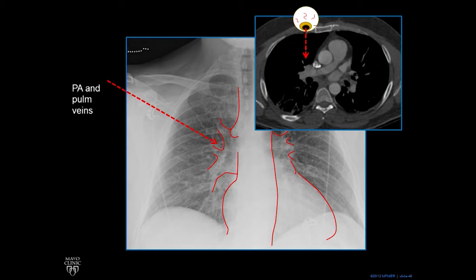We see a pulmonary artery, which is this sweeping structure, and then right in front of it, a little circular structure — that's a pulmonary vein, which is running more superior-inferior. Together, they make that hilum.